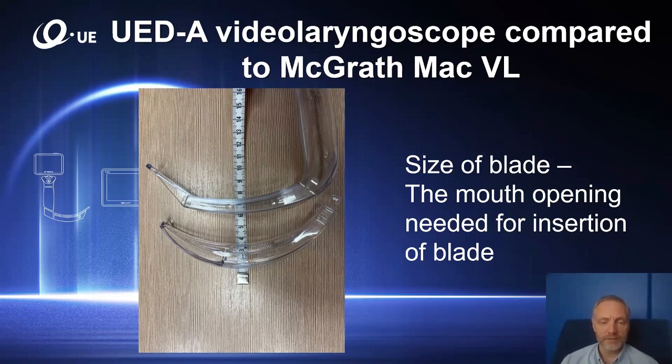From my clinical experience, I can say that thinner blades are easier to insert in the mouth of the patient, especially if there is some limitation of mouth opening. So as you can see on this picture, in my opinion, the use of the UED-A video laryngoscope should provide easier insertion of the blade in the mouth of the patient because of the diameter of this blade.